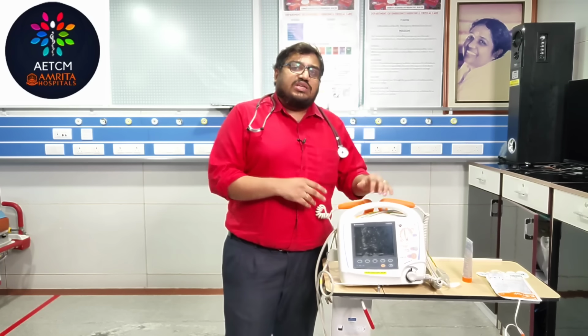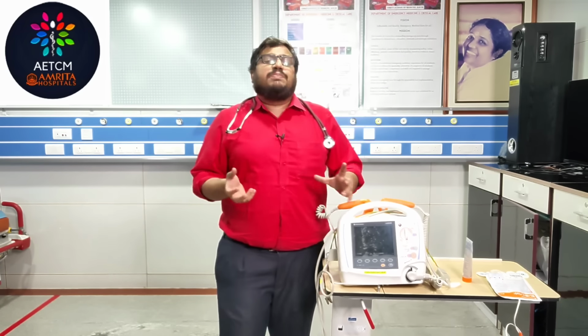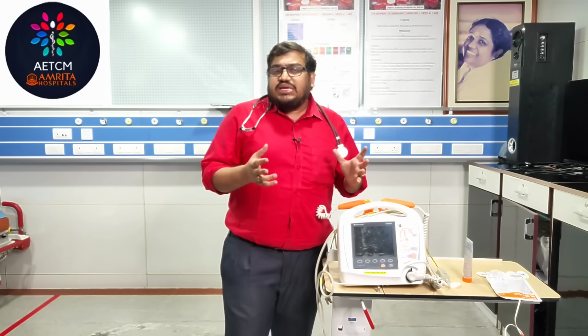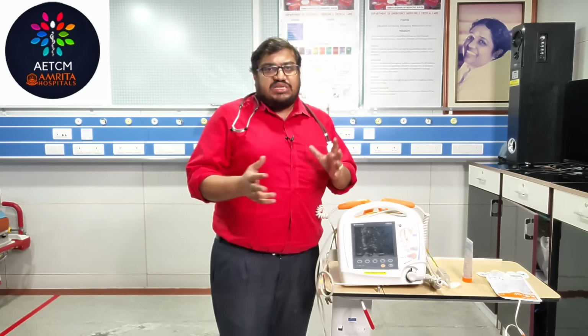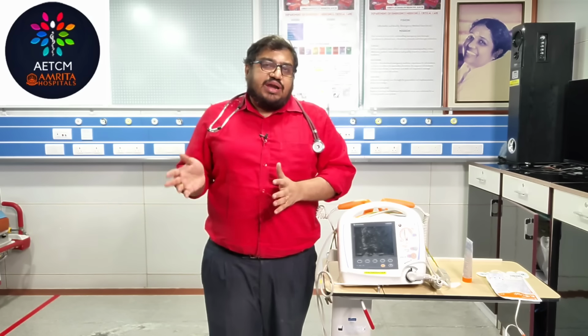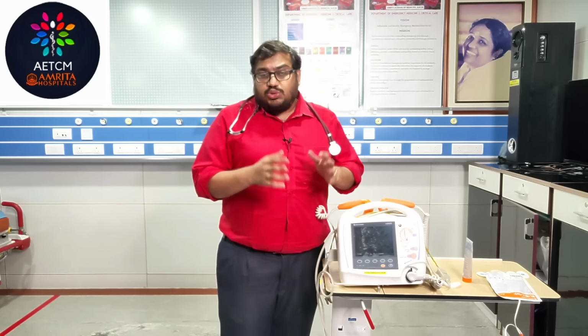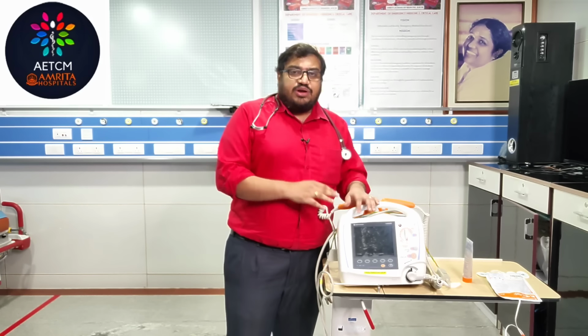And there is something else called an automated external defibrillator, otherwise called an AED. We will show that in a separate video. In an AED, you don't need any medical knowledge. You just need to attach the pads, and the machine itself will recognize the rhythm and will say what to do in a case of cardiac arrest. Maybe in our BLS video we have shown the AED, so you will understand the use of an AED. So that is regarding the defibrillator.